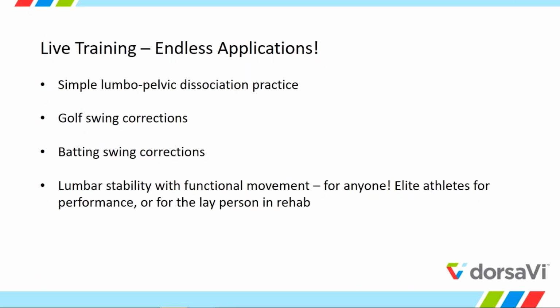I want you to do a single leg deadlift and keep those balls right in the center, because they were just flexing from their lumbar spine instead of hinging on their hip. They learn so much faster. It's super effective. You can use it in the clinic and say, okay, practice, and leave them to practice while you go do other things. You can multitask.